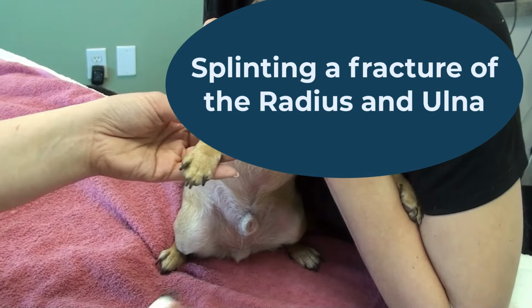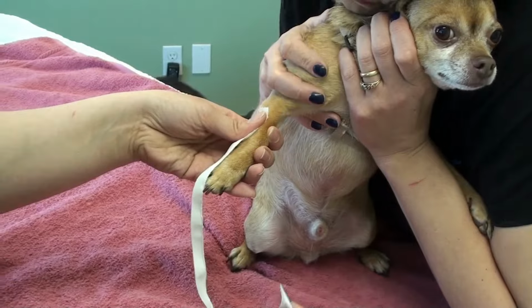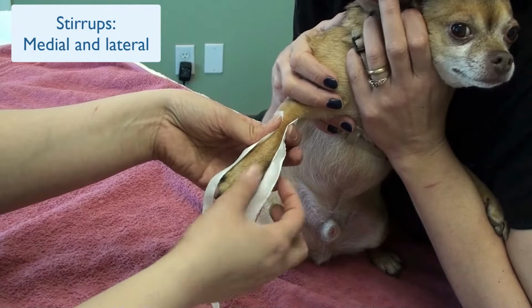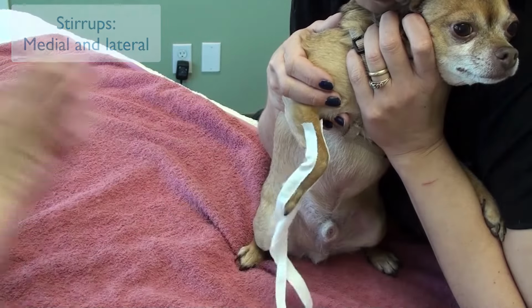How to splint a small dog with a fractured radius ulna. She is starting by applying stirrups to the medial and lateral surface of the limb, never over the pad.